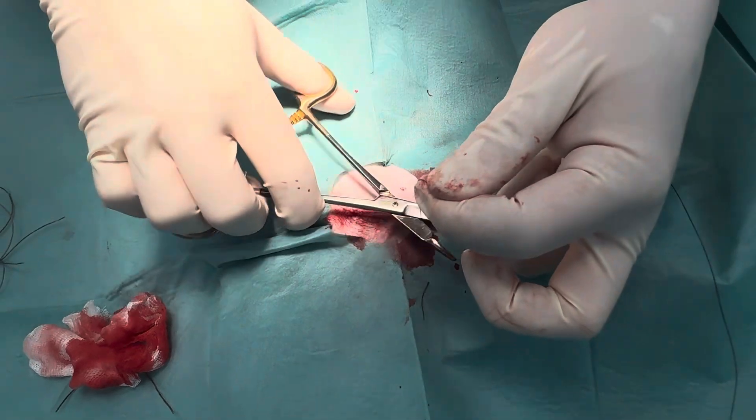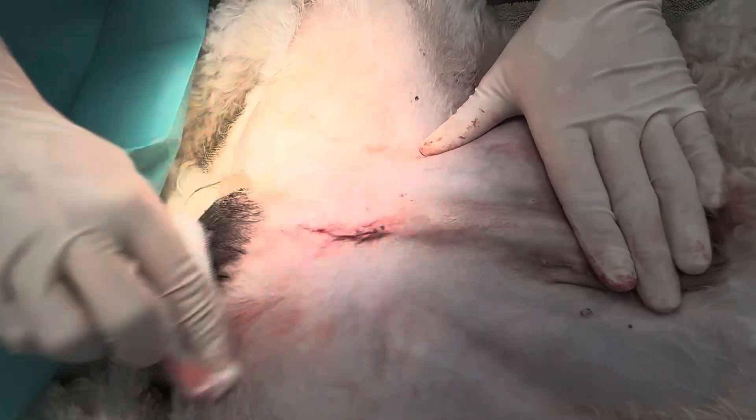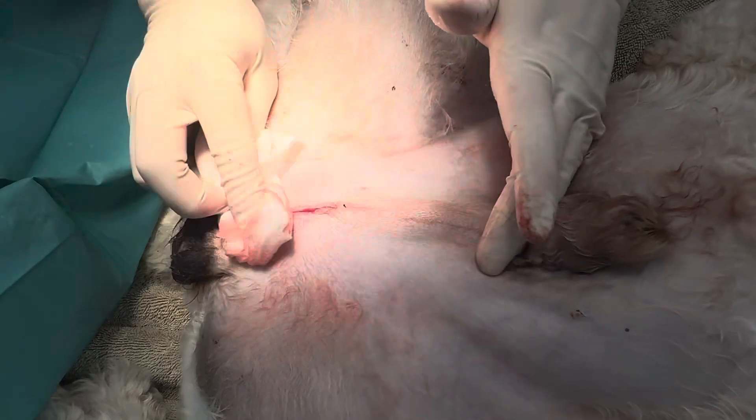Lots pulled through, and I always like to take this off and check the area. You always want to be very far from the scrotal area. Okay, hope that helps.